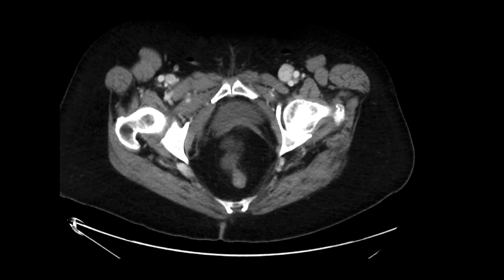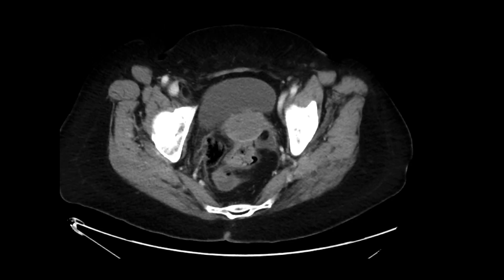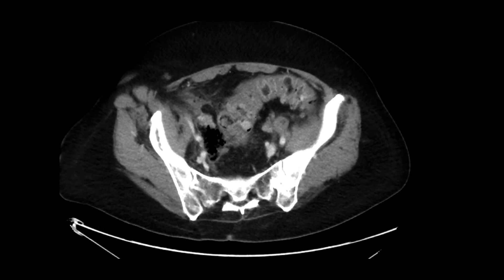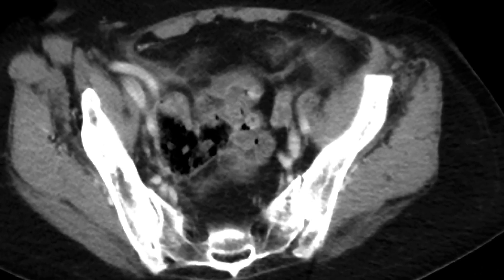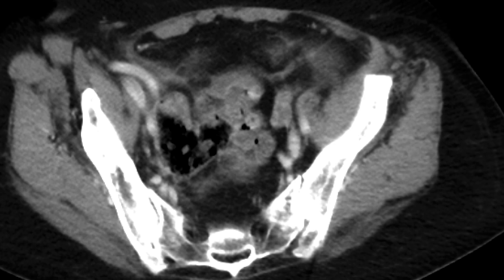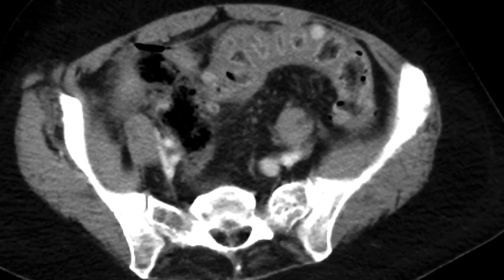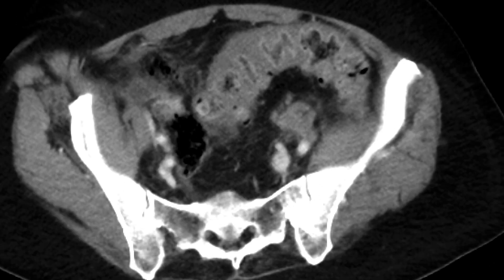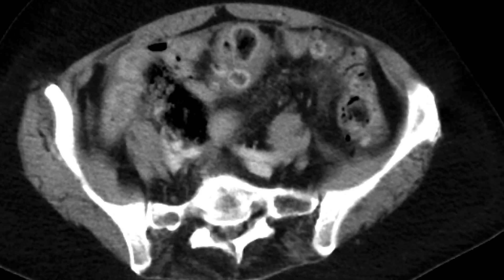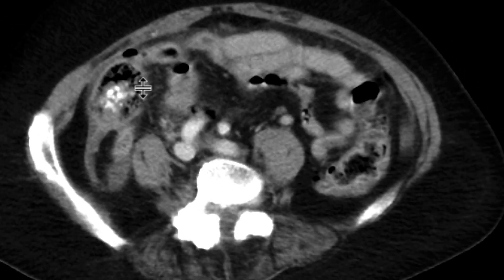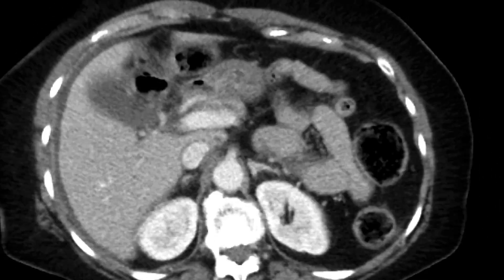As we go downwards, we start to see what's causing some of these issues. You can clearly see at the level of the upper rectum-sigmoid junction there is a break within the wall of the bowel. From that break, stool and fluid are going out into the adjacent soft tissues, causing an ill-defined collection of gas, stool, and fluid, resulting in a peritonitis — which is probably irritating some of these small bowel loops and certainly causing foci of free air and some of this fluid.